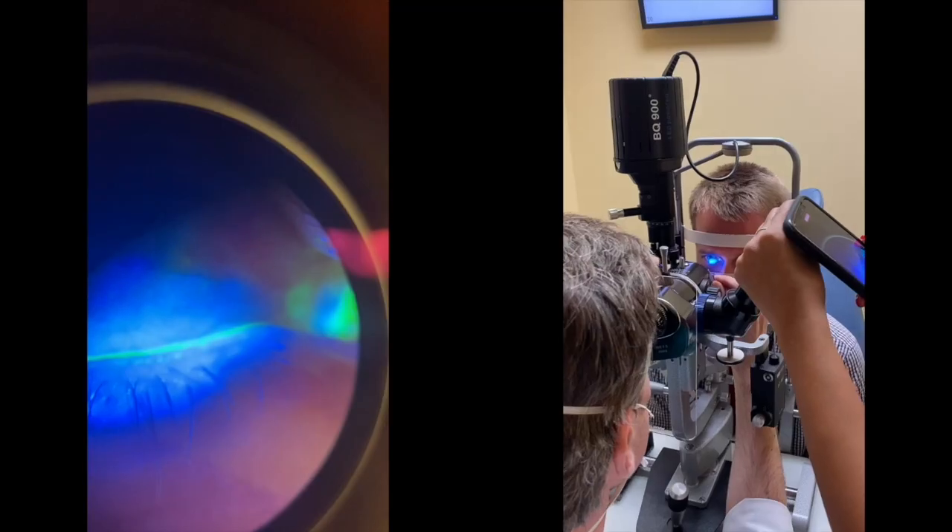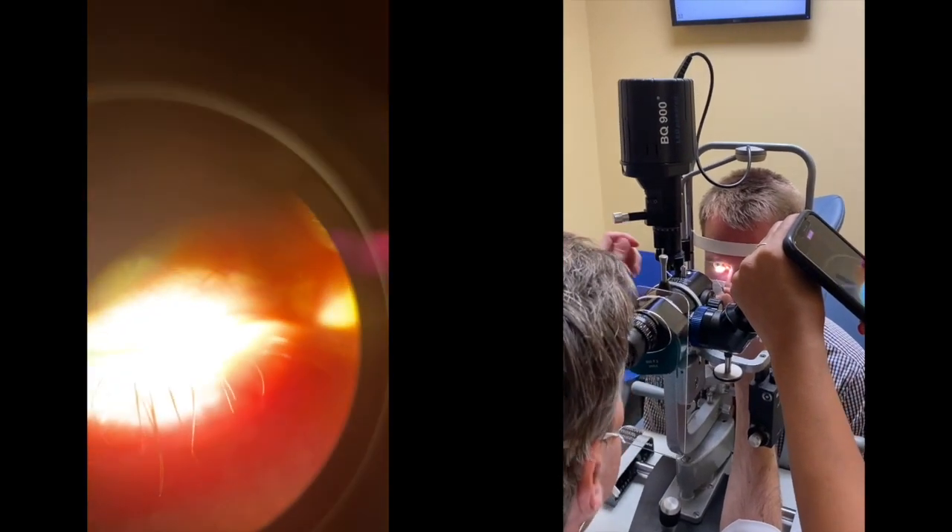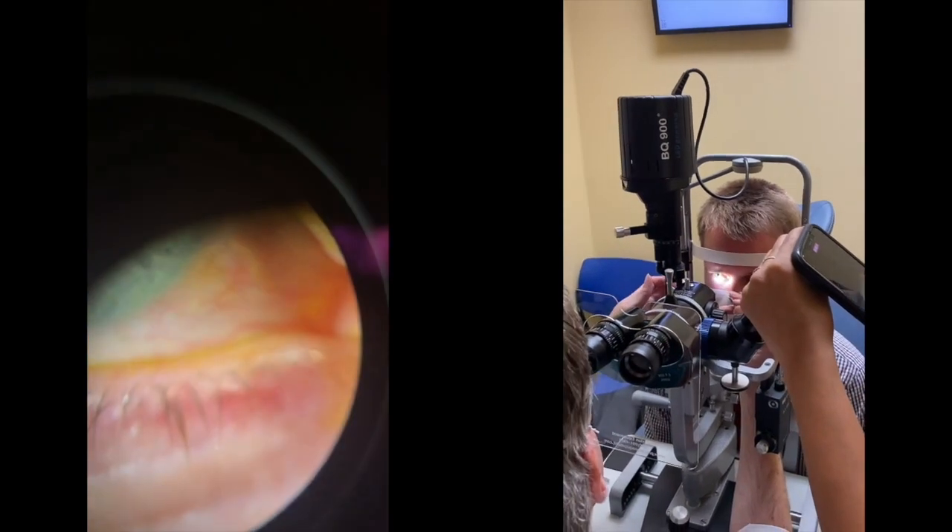This video is regarding meibomian gland probing and other techniques for lid treatment. The right lower lid has to be stabilized in order to use the meibomian gland probes.